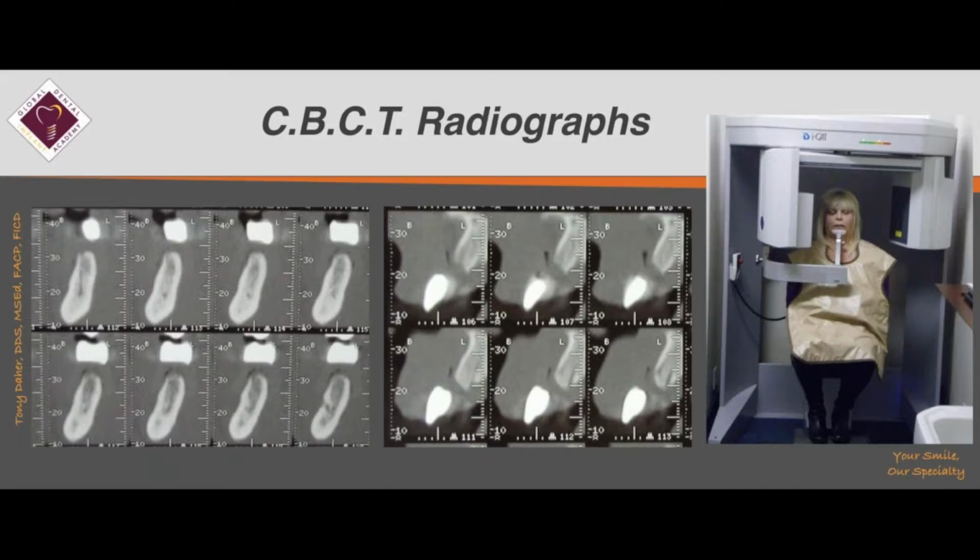But how you are going to place that implant, according to what inclination, all depends on that final destination. And sometimes, if you look at the middle slide, you might have to do bone grafting to idealize the position of these implants.